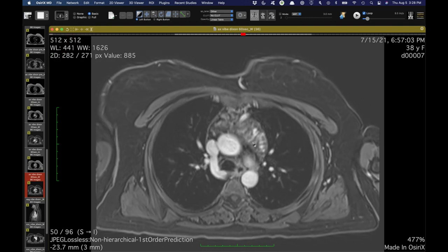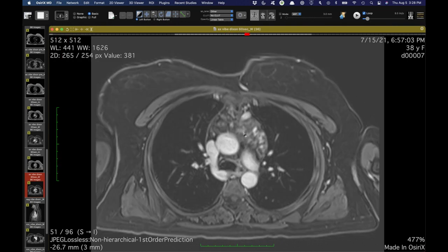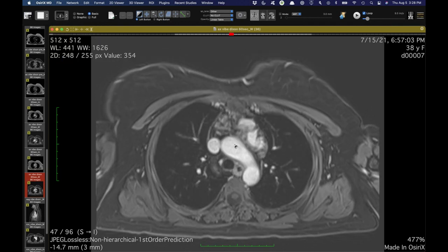But they've done lymphangiograms on this patient too, filling this thing. I see. And I don't really understand why you would have a combination of both, but don't know. Yeah, it is a complex lesion.